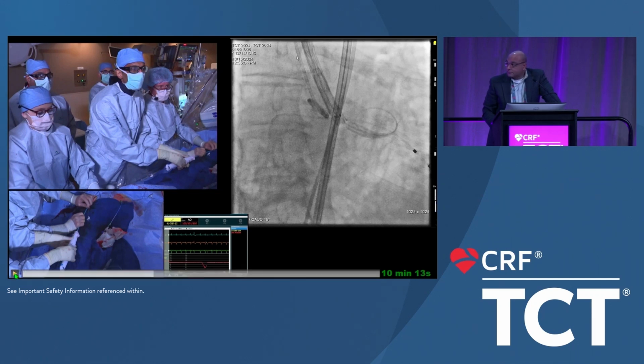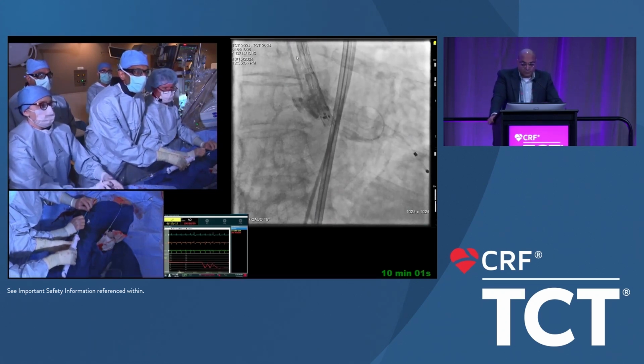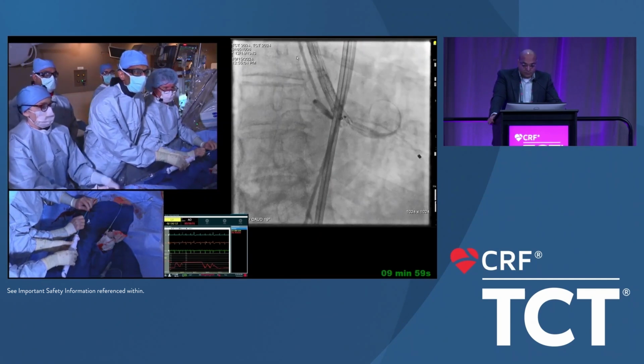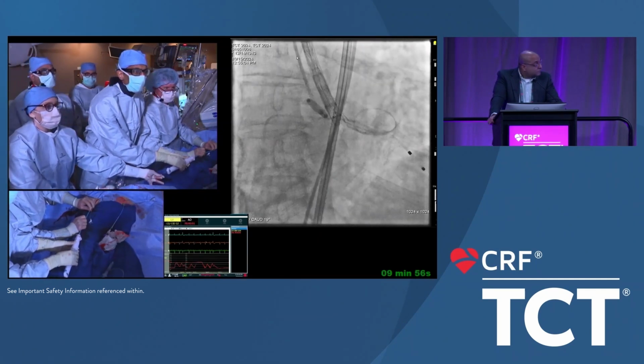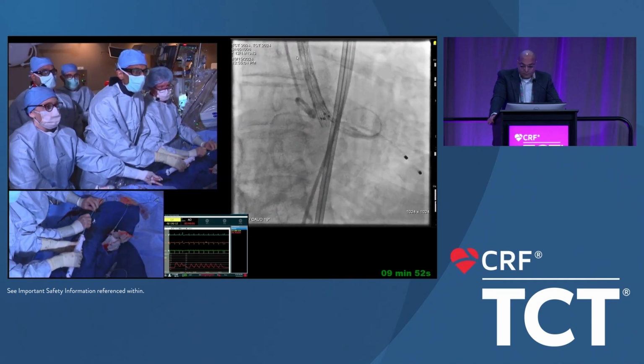So I think the markers are very, very helpful. They're just helpful at positioning. They catch your eye. It's nice to see the marker in relation to the pigtail as long as you're sure that the pigtail is where it needs to be. It has decreased our contrast usage because of the markers, so I really like the location and use them more for that than anything else.